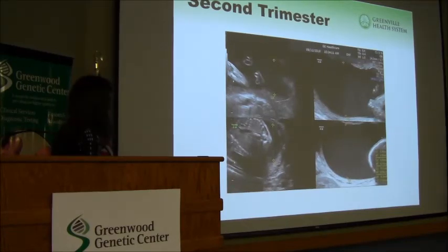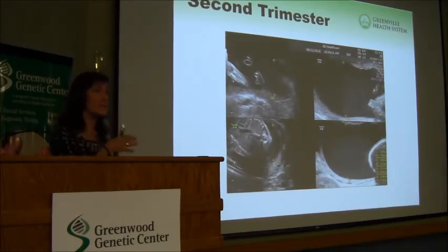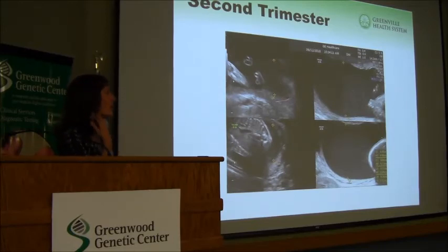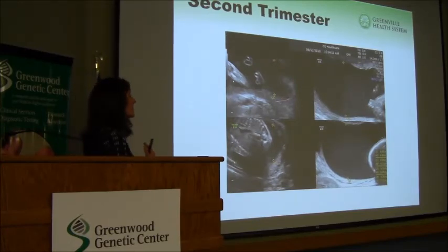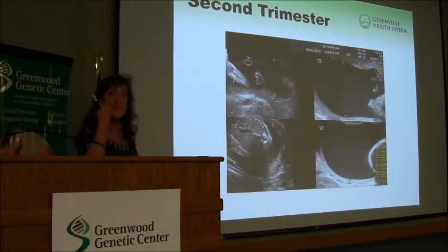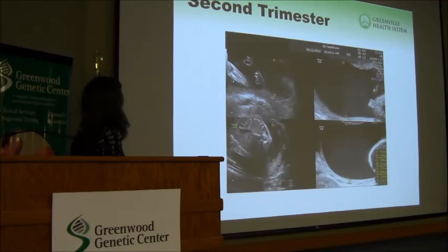I think this is the last picture, and this is just not a fetal picture, really. I'm looking at the amniotic fluid, which is generous, but it's just to tell you that we have other clues besides the baby. If there are anomalies, we see polyhydramnios in association with aneuploidy. It can also be associated with anything in the GI tract that there's an obstruction, whether it's macroglossia or a TE fistula that we might not be able to see on ultrasound, duodenal atresia, pyloric stenosis. We can also see it with neurologic abnormalities where the kid's not swallowing the fluid appropriately, so we kind of have to dig down when we see polyhydramnios and figure out what is it about this baby that's allowing that to occur.